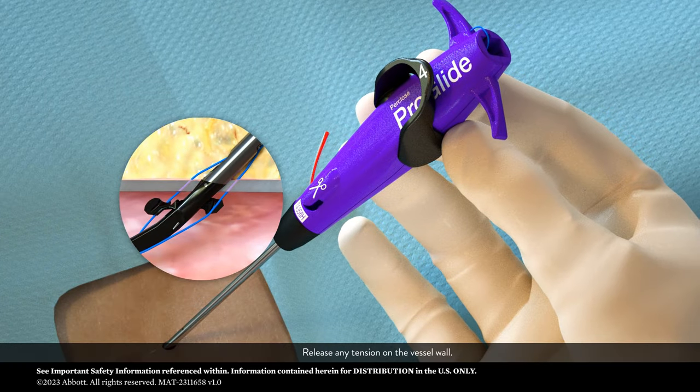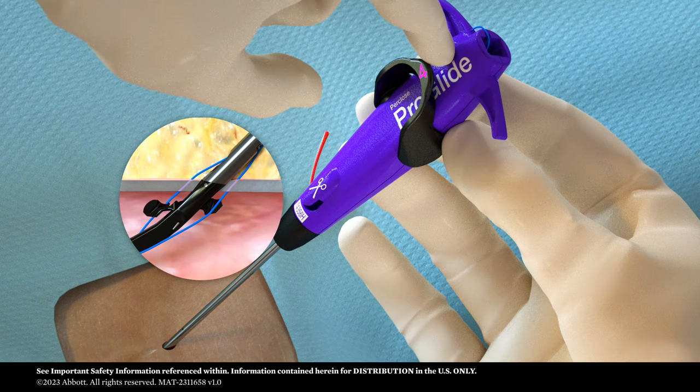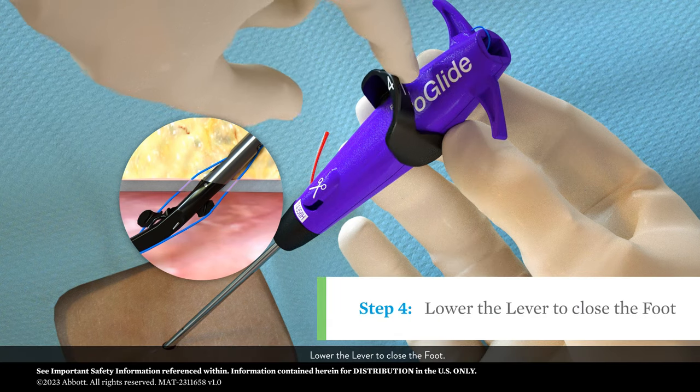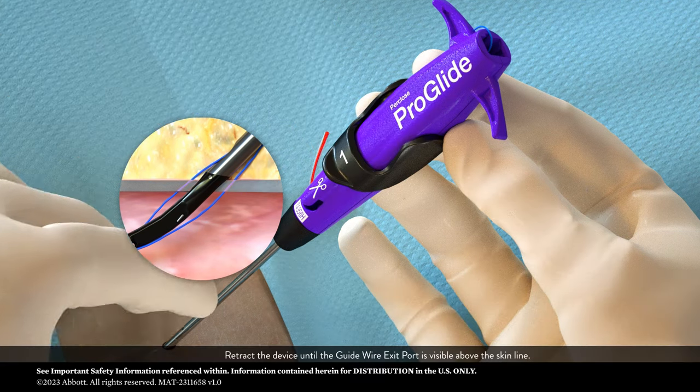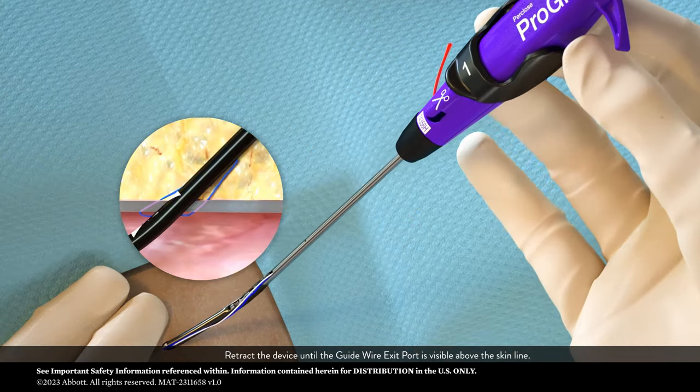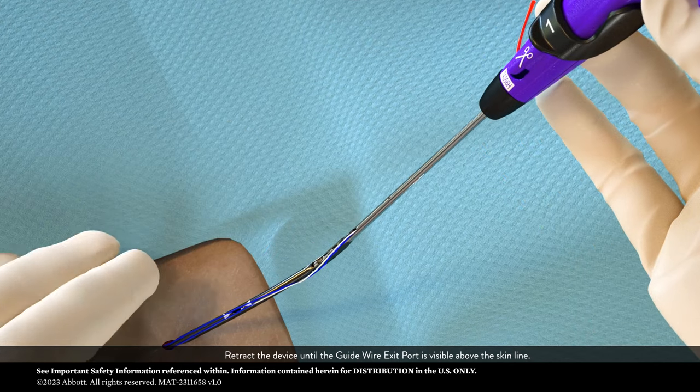Release any tension on the vessel wall. Lower the lever to close the foot. Retract the device until the guide wire exit port is visible above the skin line.